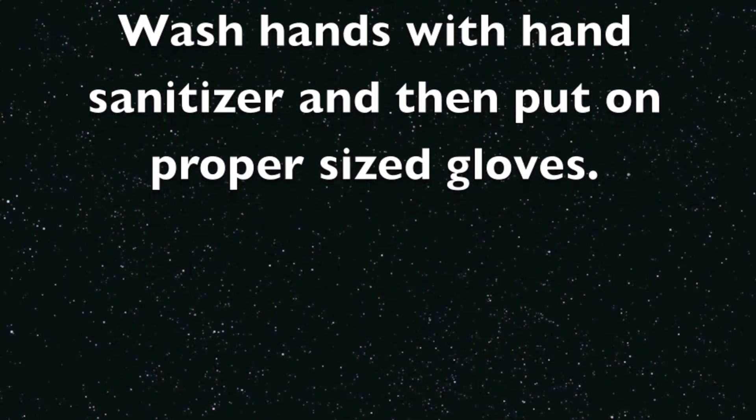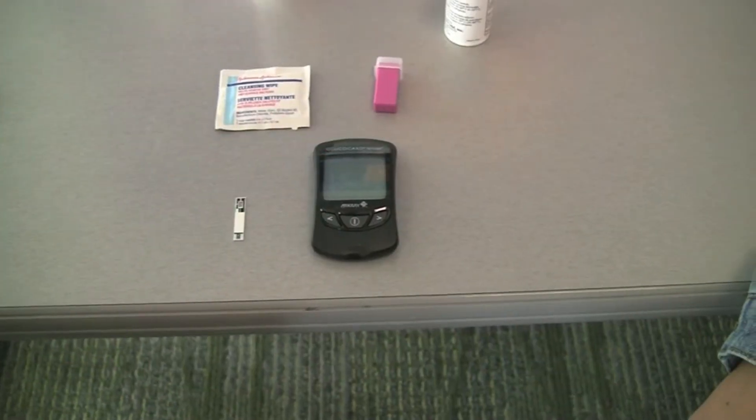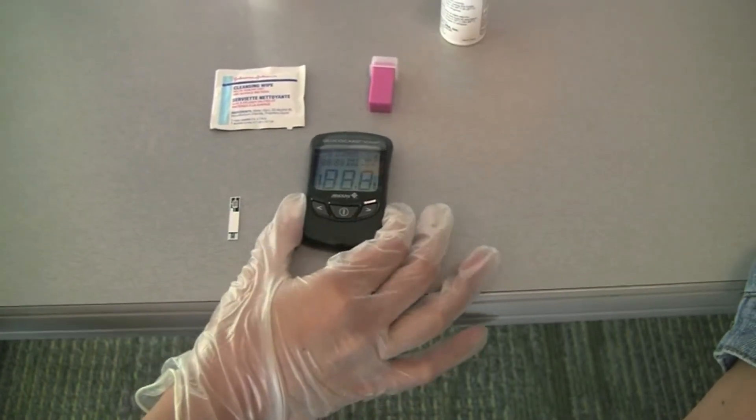Wash hands with hand sanitizer and then put on proper sized gloves. Turn on the Glucometer and place a test strip in the machine when it is ready.